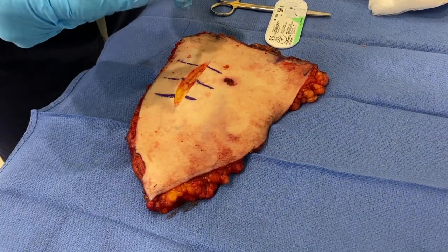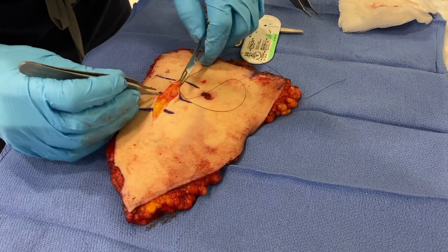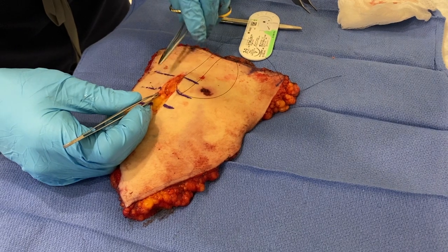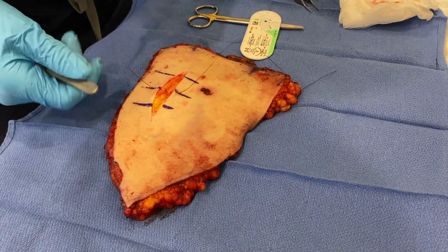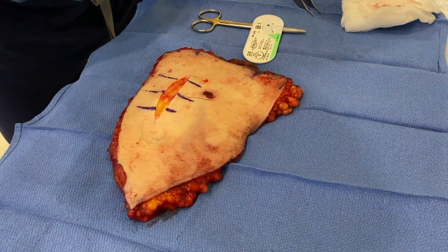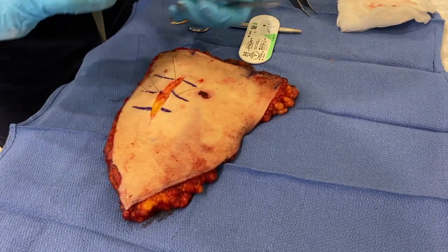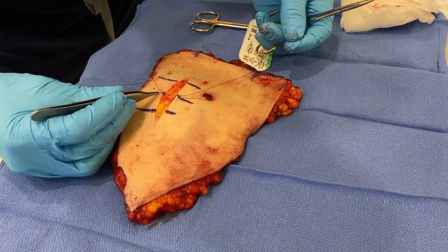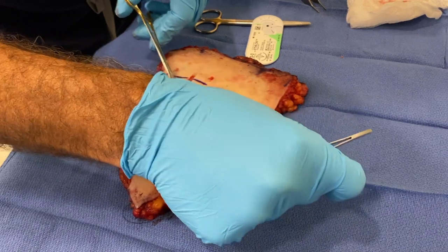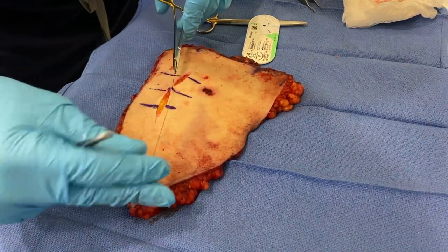Usually you're going to use a vertical mattress, so let's go over that one more time. We start further back, go superficial to deep, then on the opposite side, deep to superficial. We could tie this as a simple suture, but we want to evert the skin margin. So we go into the skin margin close, with a very small bite close to the margin. If you go too far back with that last pass, the skin margins won't come together. Make it a fairly small bite on that last bite, and you can see that brings your tissue together very nicely with a minimum amount of tension.